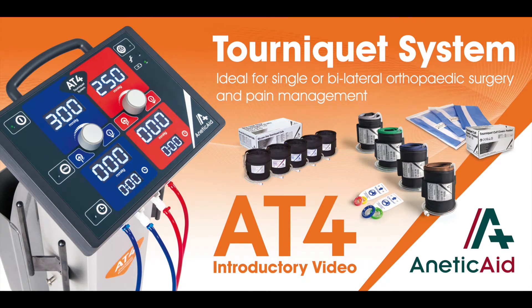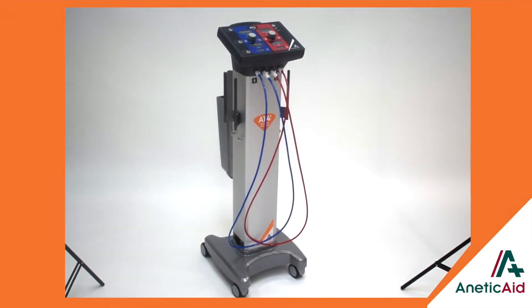Welcome to this EneticAid video about the AT4 electronic tourniquet. The AT4 is a compact, lightweight and robust tourniquet unit offering advanced technology combined with maximum safety and reliability. It is ideal for single or bilateral orthopaedic surgery and pain management.